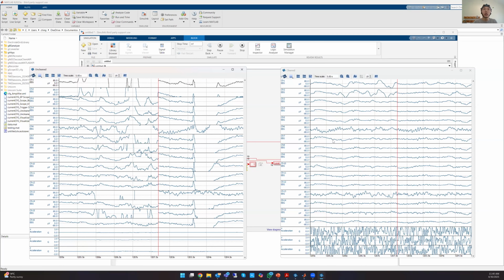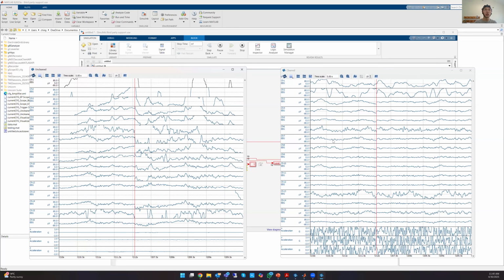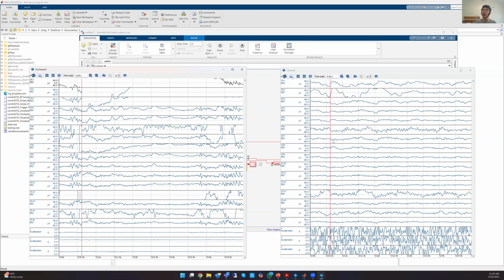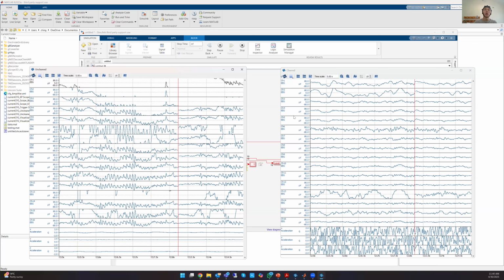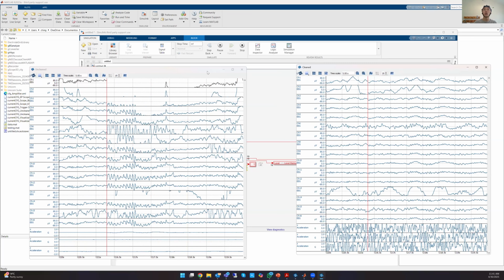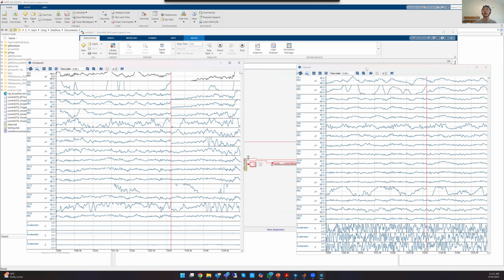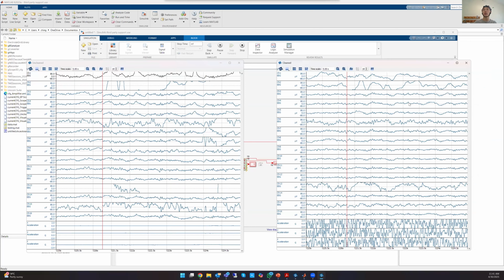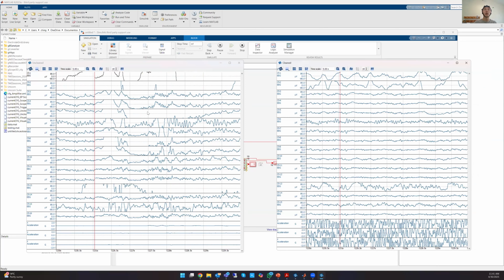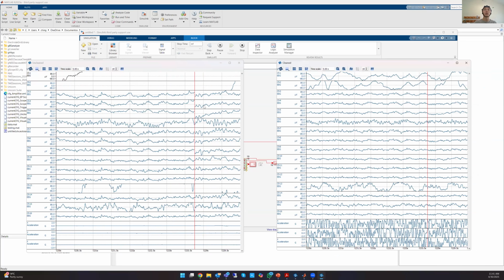So you can see the EEG data is really responsive, but since these are dry electrodes, if there is lots of head movement, of course there are artifacts. But if we're using the OSCAR block for artifact removal on the right-hand side, as you can see, the data are mostly clean. I would say 90% clean. Even if I'm speaking, talking a lot, biting a lot, eye movement.